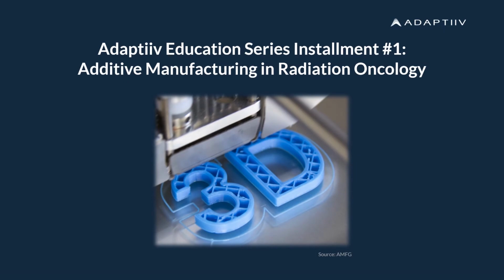By the end of this series, you'll be able to define additive manufacturing and understand how it relates to creating patient-specific accessories in radiation oncology. The RT community is primarily focused on Fused Deposition Modeling, or FDM 3D printing technology to this point. However, other technologies are at or near the forefront. To that end, a comparison of common 3D printing technologies such as FDM, SLA, SLS, and jetted printers will be reviewed in this series.